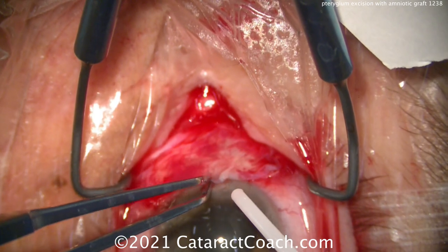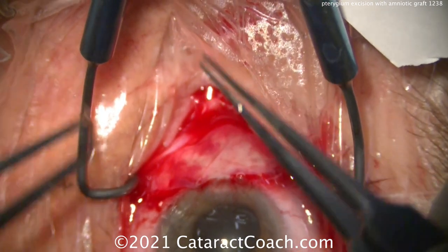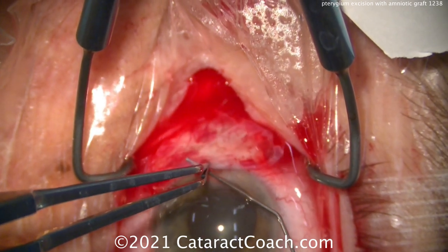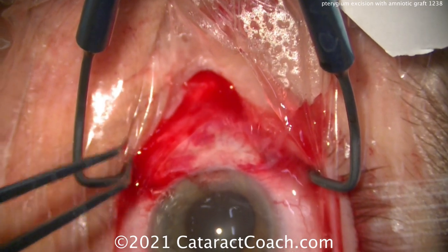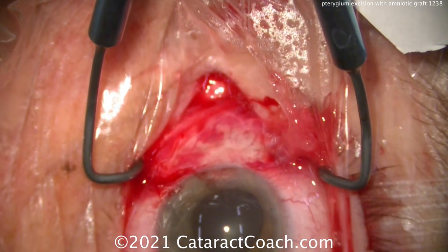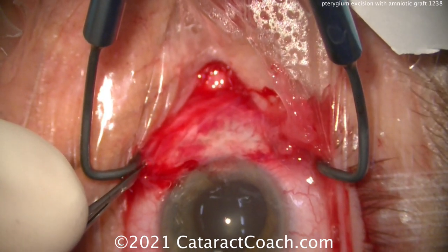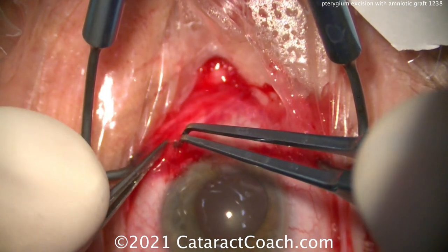This is the fibrin glue that has two components. We'll put the first component in — this is the thicker one with the larger cannula, so that goes in first. Then we can use these two forceps to really smooth that out and spread that glue all over, underneath there as well, up into those conjunctival pockets that were created. Now here's the second component of the glue — it gets activated very quickly, so we'll put about an equal amount on there. Using the two forceps, again spread and smooth it out. I don't want any lumpy, clumpy areas. There's a little spot here of clumped tissue — we'll cut that if we need to. We want it smooth, smooth, smooth, tucked into position. We can put a little more glue here to close up those conjunctival pockets — this glue works pretty quickly. There are no sutures involved, so the patient is a lot more comfortable.